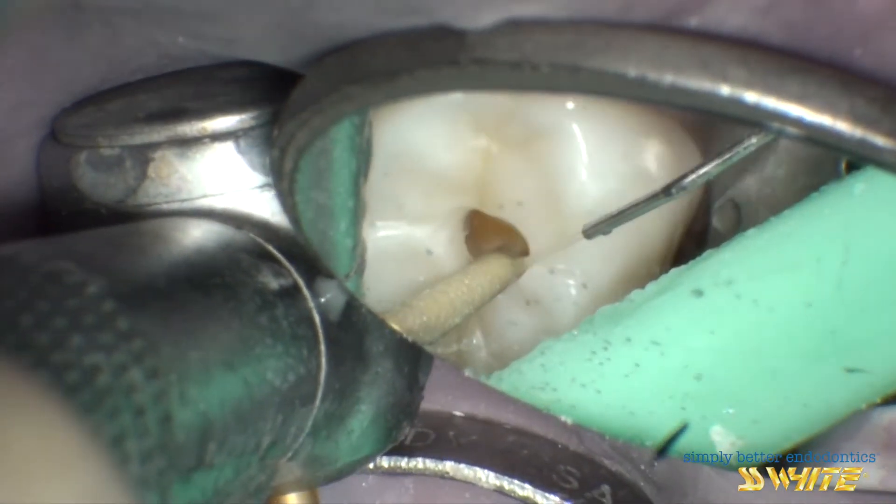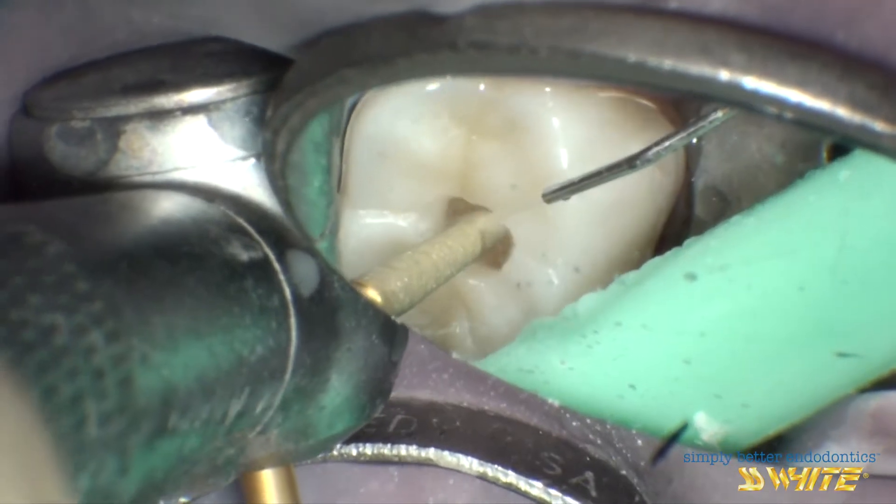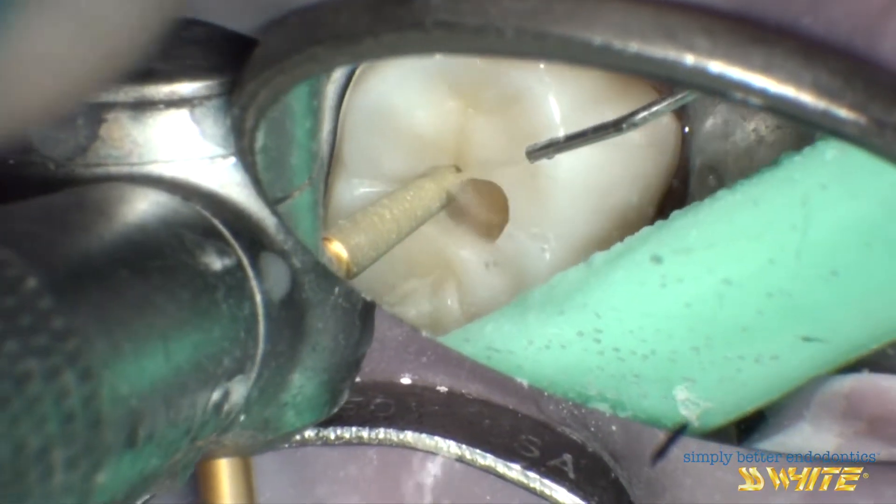After opening through the occlusal surface, we switch to the 856 Round Tip Tapered Diamond and start extending the outline.